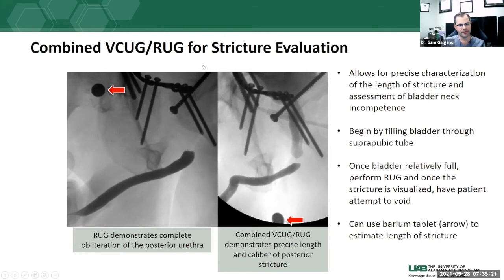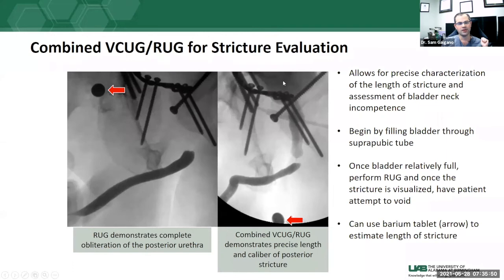The combined study images demonstrate: first the initial retrograde urethrogram showing obliteration of the urethra, then the combined VCUG and retrograde urethrogram showing exactly how long and to what extent the urethra is strictured. A barium tablet provides a reference point for size measurement. This gives surgeons excellent information when planning their procedure.